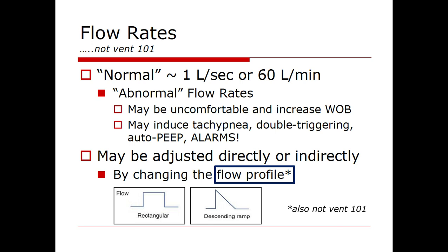So people who've been around know that I like to make a joke of what is, Schmug, do you know what the first rule of ICU medicine is? Make the beeping stop, okay? ICUs exist for the nurses and the monitors, and if none of the monitors are beeping, then probably everything is okay. And the number one cause of beeping in the ICU is that the peak pressure alarm on the ventilator is going off.